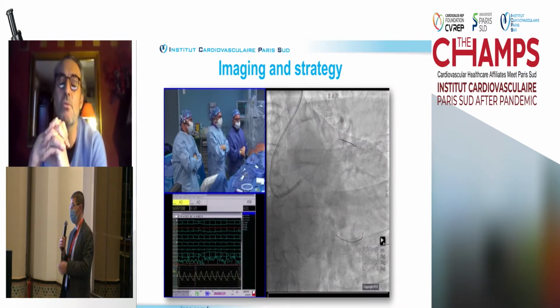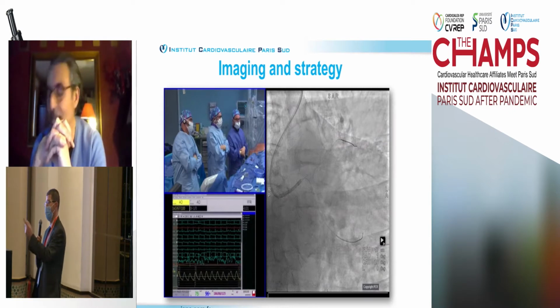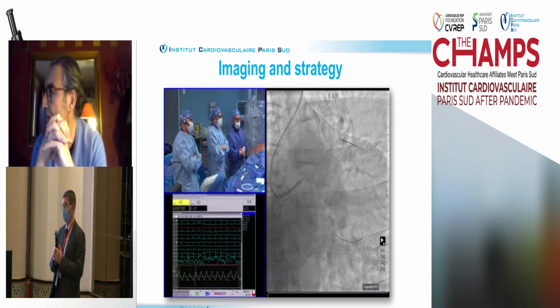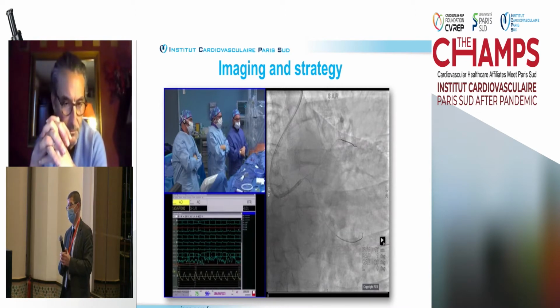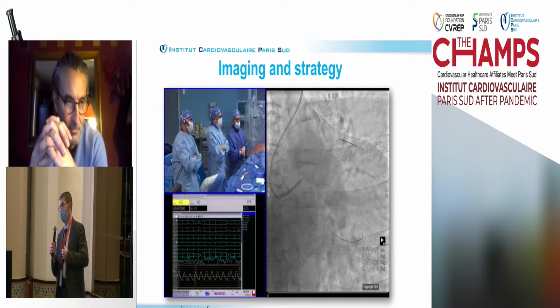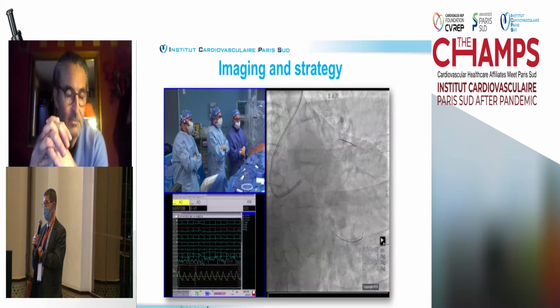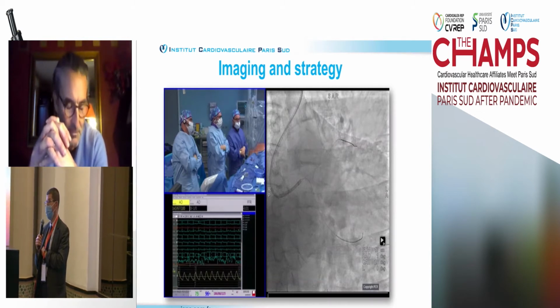Okay, let's take the opinion of the panelists first. How are you going to manage? If you look at the picture, the main bulk of the stenosis is not involving the ostium of the circumflex and also not involving the ostium of the diagonal branch. Yeah. So the strategy is to fix the left main and LAD, open the struts, and take a decision after that. But you have the diagonal also 70% in the mid part, not ostial. No, it's not ostial. It's a proximal lesion.